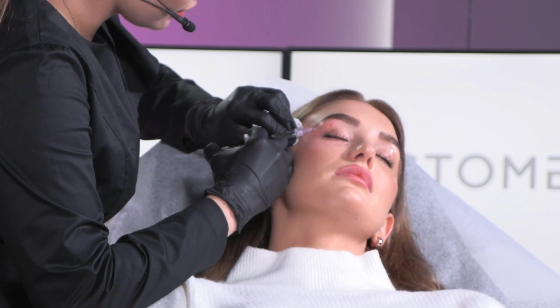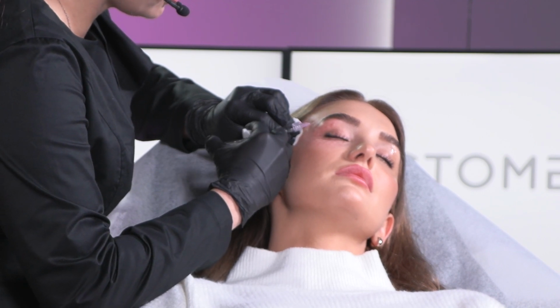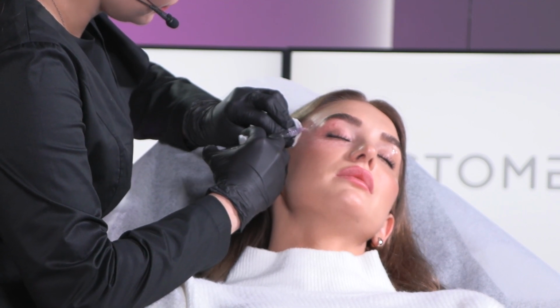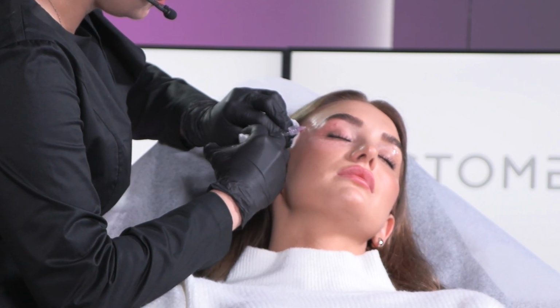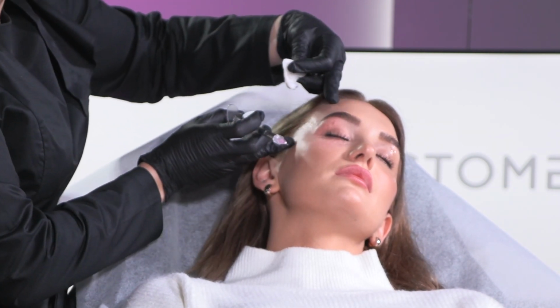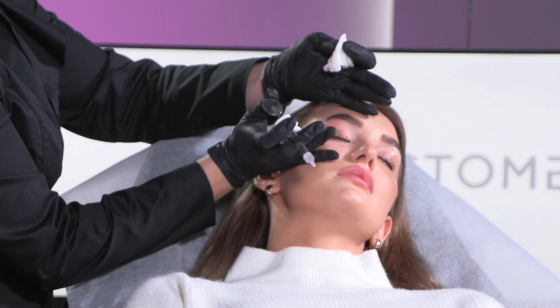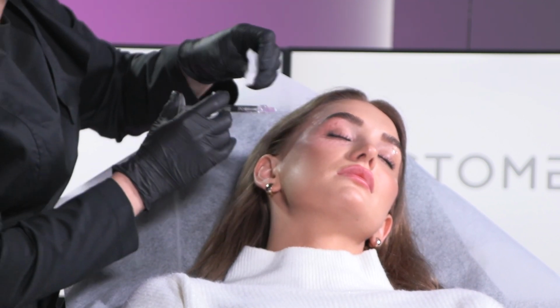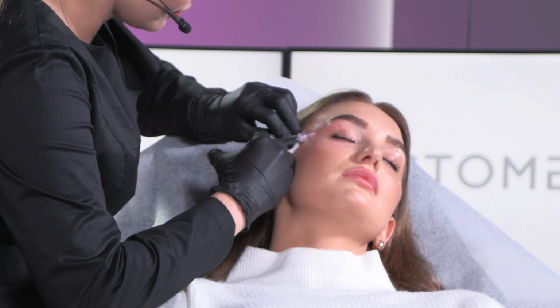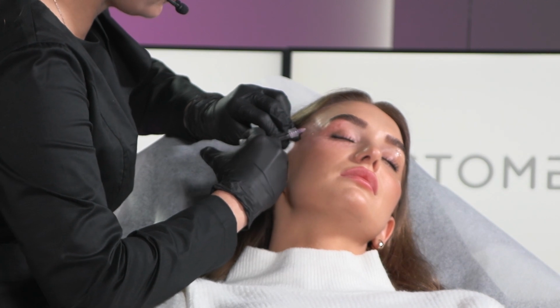And now, sorry, I will go to this temple side. She doesn't have numbing here, so just let me know how you feel, please. Is it okay for now? Okay. Because as I said, it's not only around the eye area. We also go to the temple, we go to the hair growth, because we want to pay attention, like you wear glasses, to all this area. And think of the combination, the product can give a very good lifting effect.